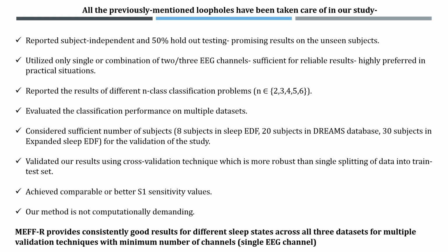Further, we have used the 10-fold cross-validation technique, which is much more robust than a single splitting of data. We also achieved comparable or better S1 sensitivity values, and our method is not computationally demanding. Overall, MEFFR provides consistently good results for different sleep stages across all 3 datasets for multiple validation techniques with a minimum number of channels.